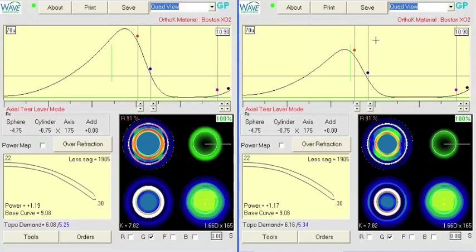So in other words, if we had started with this lens on the right, discovered the patient was getting glare and halos, and decided to increase the size of the OZ by 1 millimeter, we would gain about 0.02 millimeters in tear film underneath the 20 micron line. And so I don't change the OZ too often for the purpose of glare and halos. I haven't found it to be super helpful. Once in a while it is, and I don't know exactly when to do that.